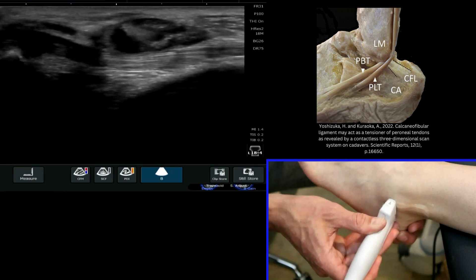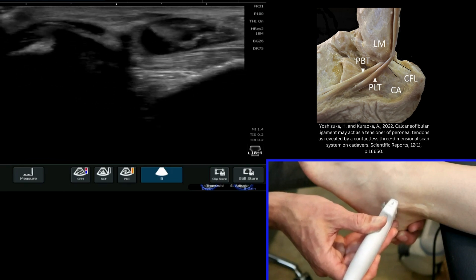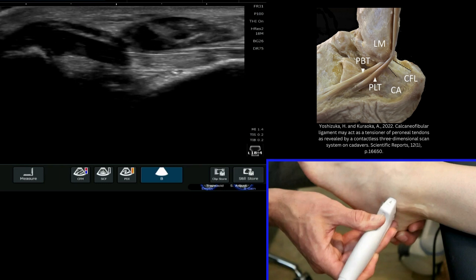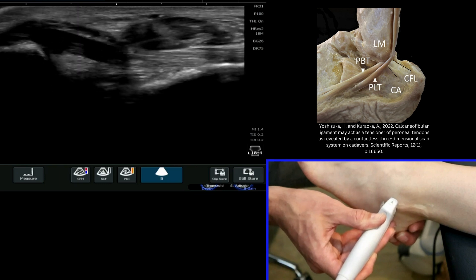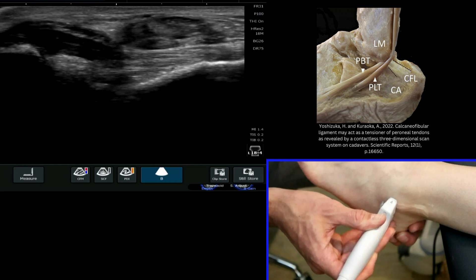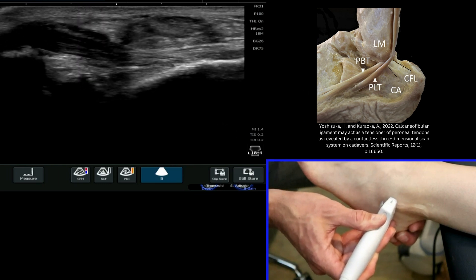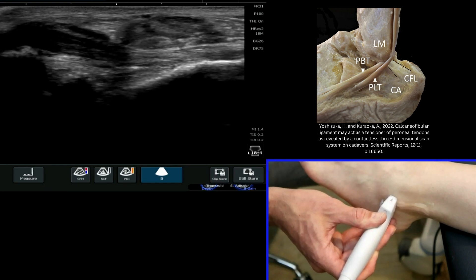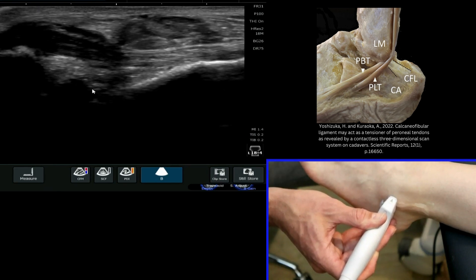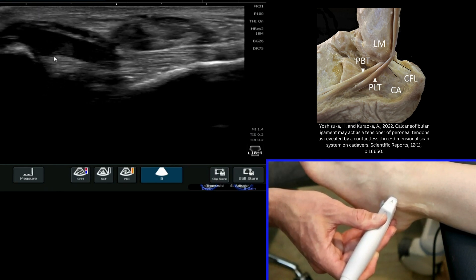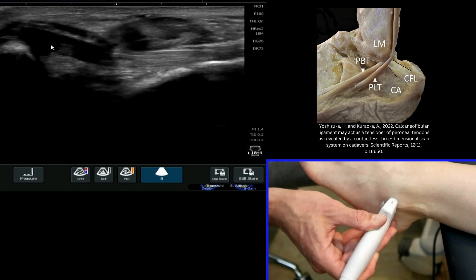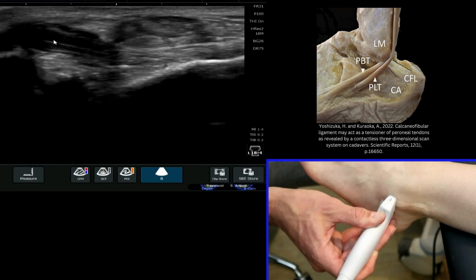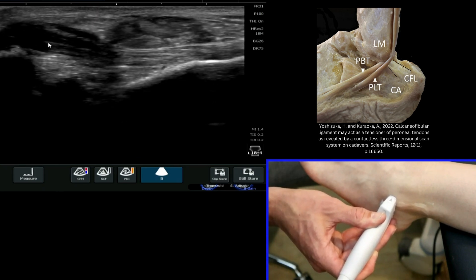It's always very difficult to see the fibular origin because of the steep angulation of fibres. You can see that it's darker here, and that's often the effect of anisotropy affecting my ability to see those fibres thoroughly.